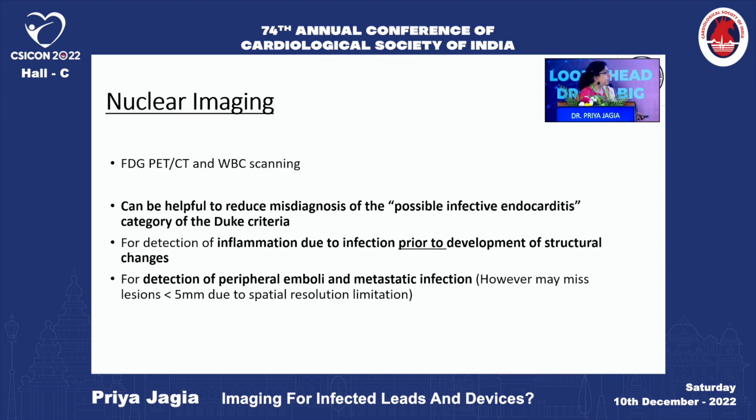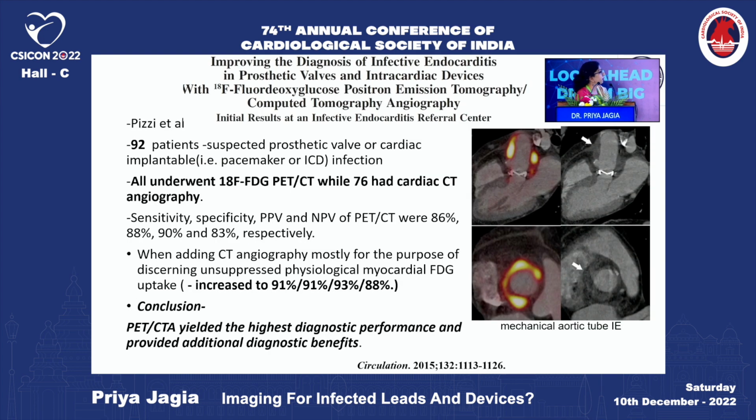But important thing is, remember, you have a spatial resolution limitation with FDG PET. So smaller emboli less than 5 mm may be missed on FDG PET. So this is a paper which had talked about FDG PET and combining it with a CT angiography or not. So patients, all of them underwent PET. However, 76 out of the 92 had cardiac CT along with the FDG PET.